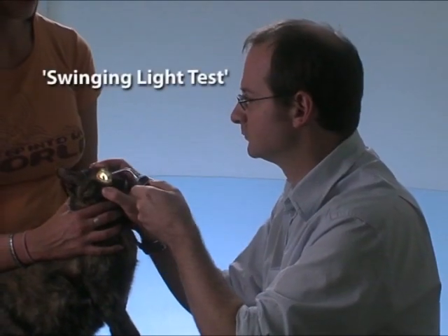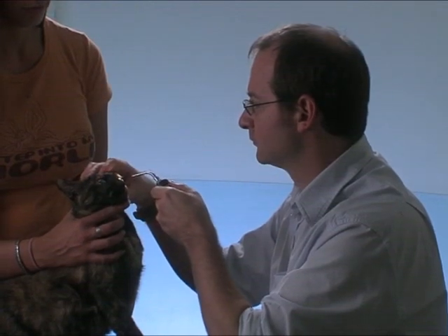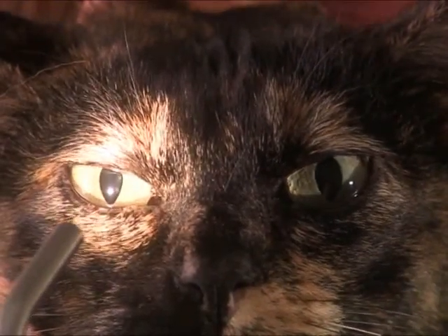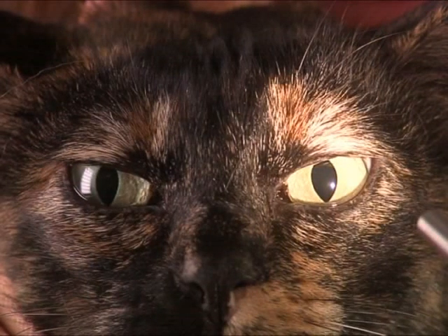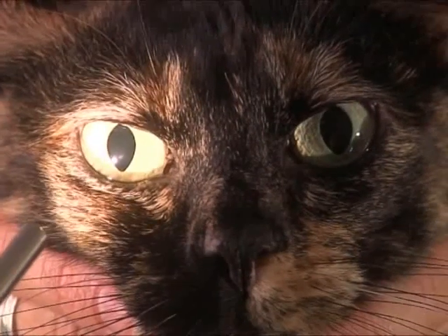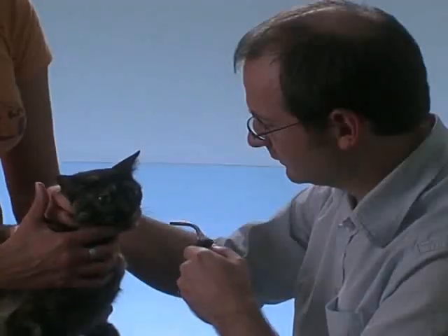The so-called swinging light test is a practical aid for checking both the direct and consensual pupillary light reflex. This involves stimulating one eye and observing the direct response, then swinging the light across to the fellow eye. When the light strikes the fellow eye, the pupil should already be constricted and remain that way until the light is removed. Note that both eyes should always be tested for the direct and consensual response so that the results can be compared.